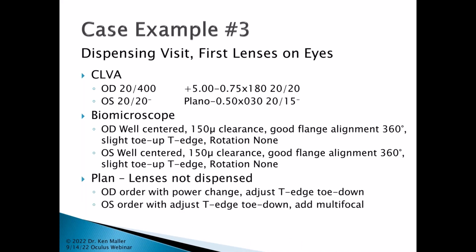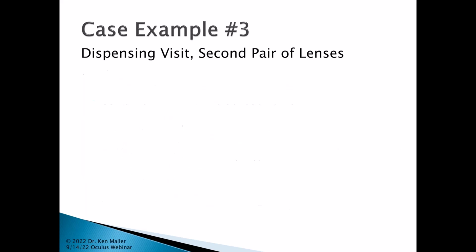And so I decided not to dispense the lenses, given that it was so hyperopic on the right eye. I ordered a new one with the power change, adjusted the temporal edge to bring the toe down. And on the left one, since the fit was so good and we were pretty much dead on, I ordered it with a little adjustment to that temporal edge to bring the toe down, but I added the multifocal into that one as well.